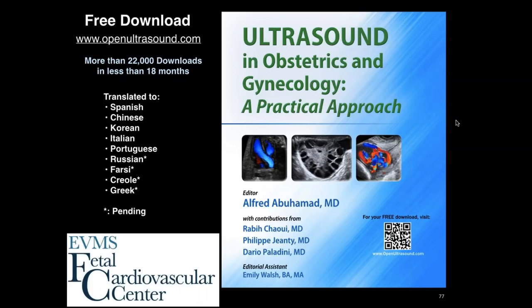You're welcome. Do you need sagittal view of aortic and ductal arches if you have 3-vessel trachea view? Frankly, I would say no, with the risk that I may be controversial, but I would say no. I'm not sure what the sagittal view of the aortic arch or the ductal arch would add to a normal 3-vessel trachea view to me. I can't see what it would really add beyond what I could see at the 3-vessel trachea view. So I would say probably not, in my opinion. If you can get it, you can get it.